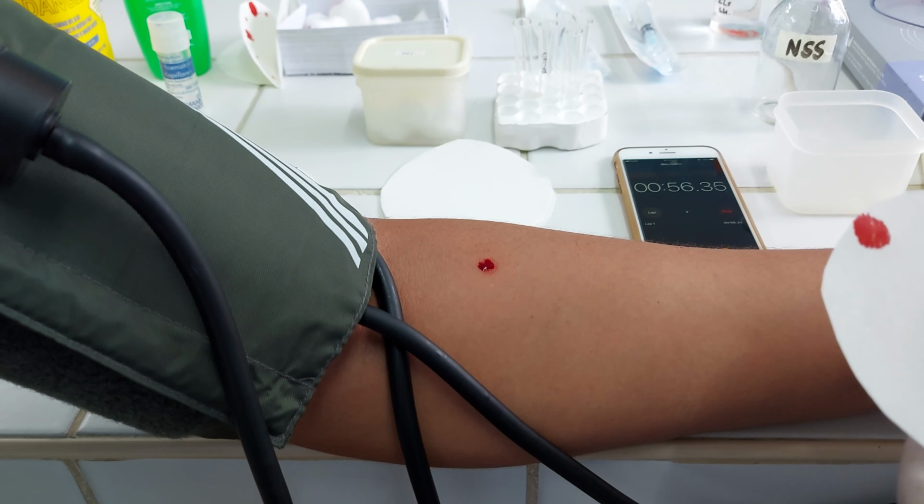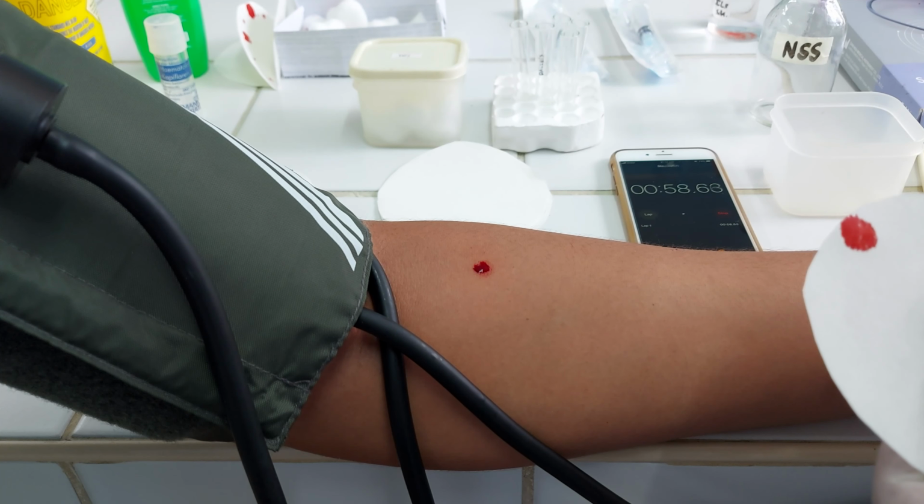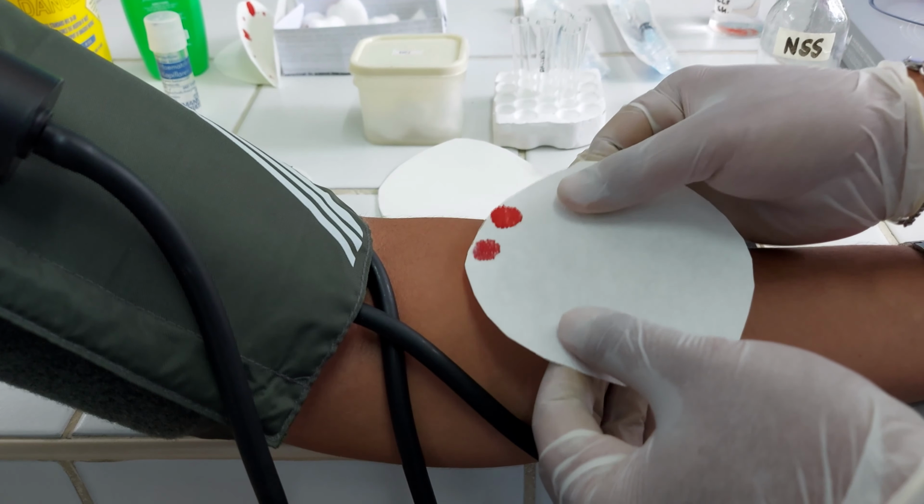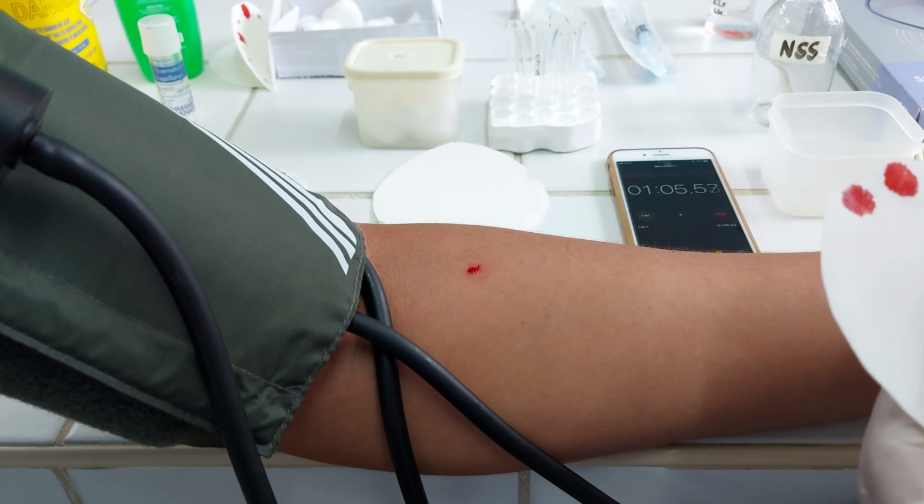Remove the blood pressure cuff and carefully clean the area with cotton. And apply a bandage vertically and keep it in place for 24 hours.